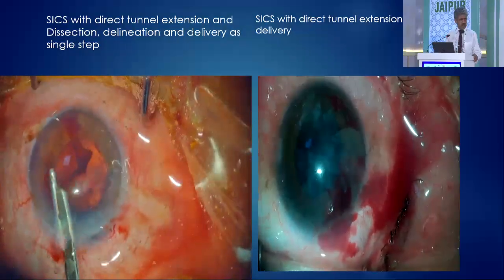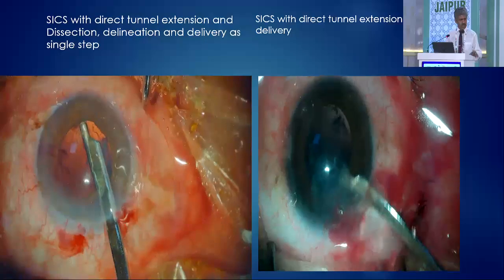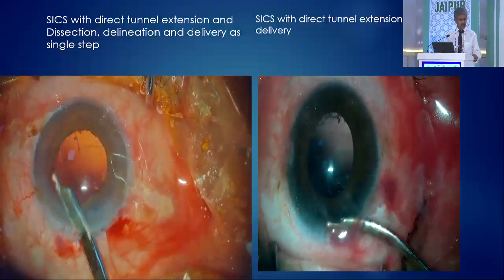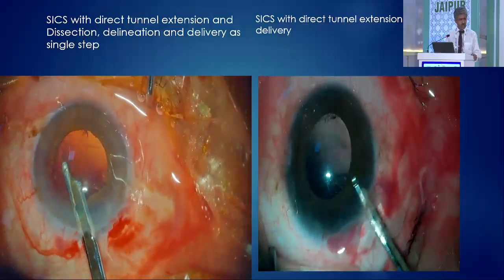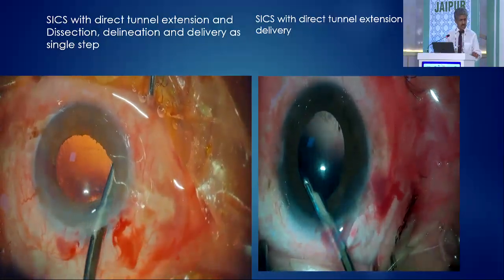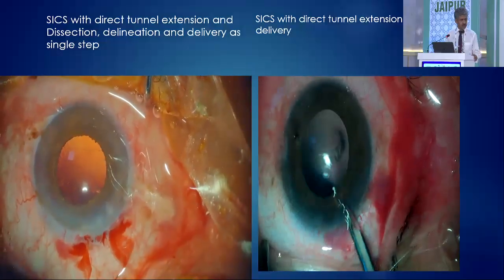This is a real-time unedited video. The total surgical time was almost 4.58 minutes, hardly 300 seconds, without any addition in these two videos. In the hard category, there was slight zonular weakness, and both were shaky. That's why I usually decide during the capsulorhexis whether to go ahead with small incision cataract surgery or not.